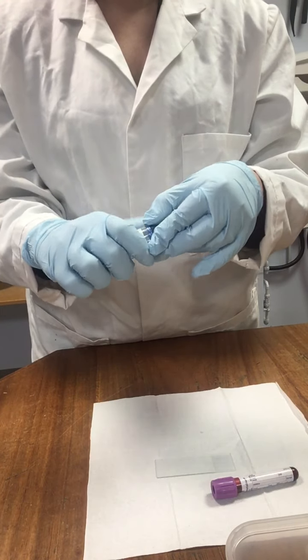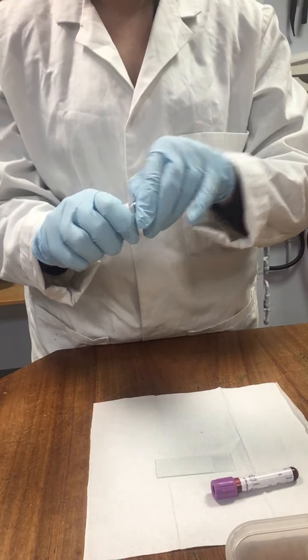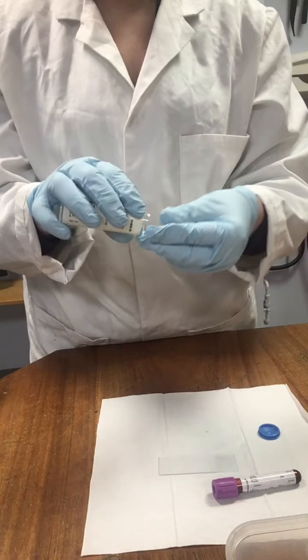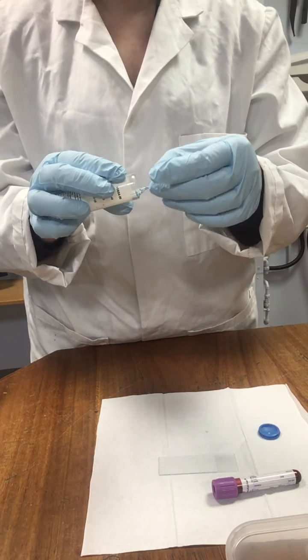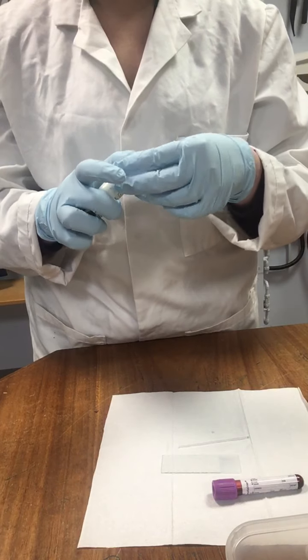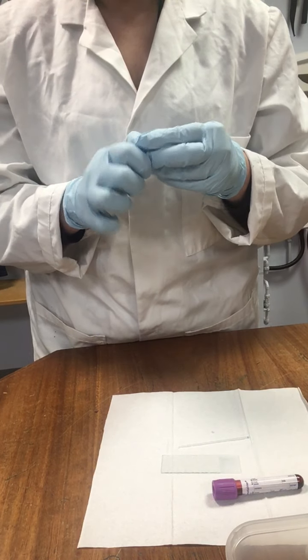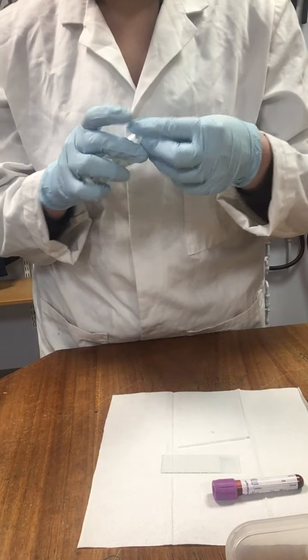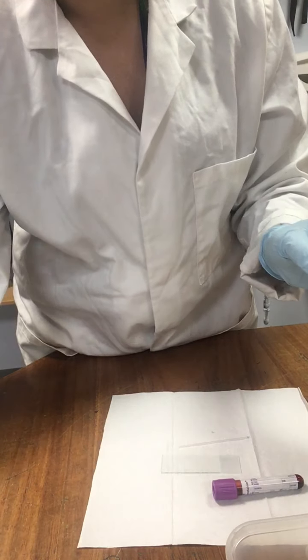So what you want to do is to take a hematocrit tube, just take the lid off the tube, and we just literally want one of these. Just pop it down on your workbench, pop the lid back on, just to avoid contamination. Pop that to one side.